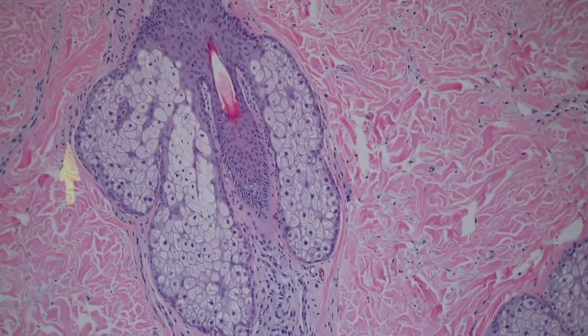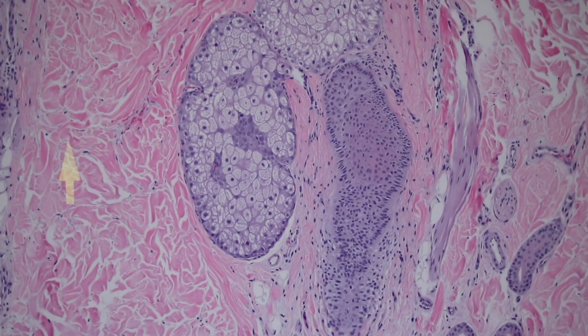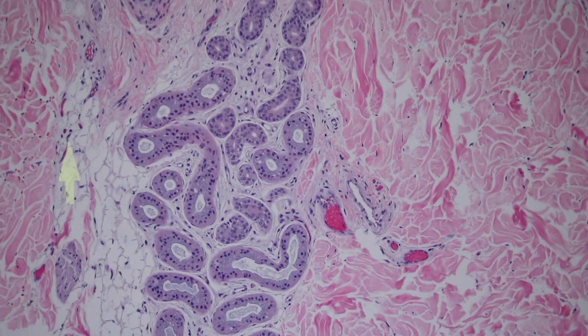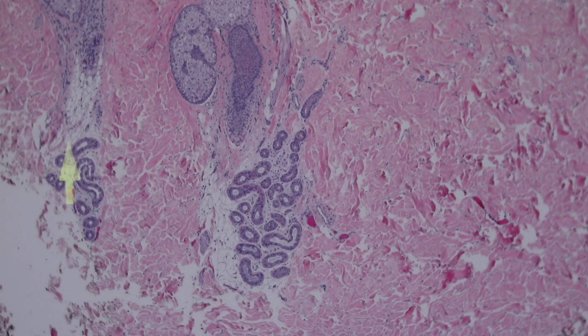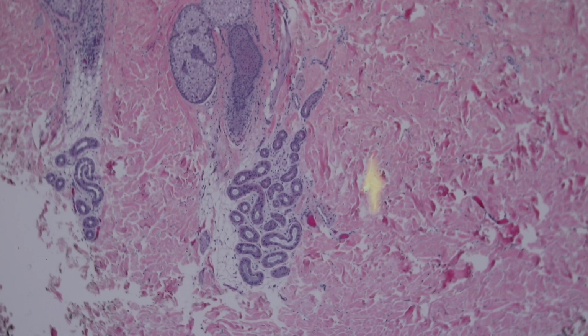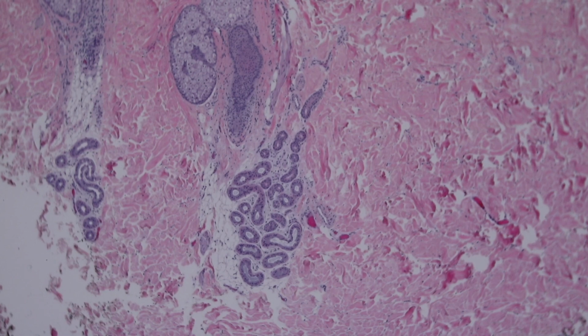So we've covered many of the structures. I think we have one more I wanted to show you in here. Yeah, these. So this, I showed you earlier, is a sweat gland. This is an eccrine sweat gland, the kind of liquid, watery sweat that you get when you get sweaty palms if you're nervous. That comes from these glands, and these are called eccrine glands, or the word we often use is the eccrine coil, because it is a simple little tubular gland that's all tangled up into a coil. And it makes the sweat, and then the sweat is secreted out through this little tube called the duct, the sweat duct.